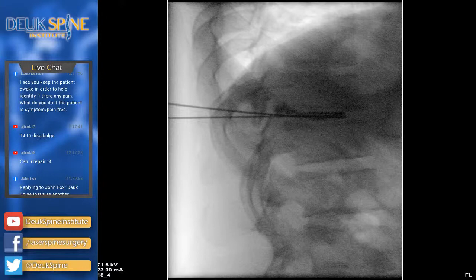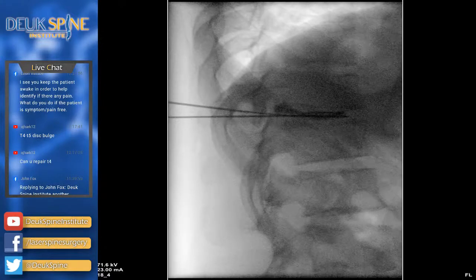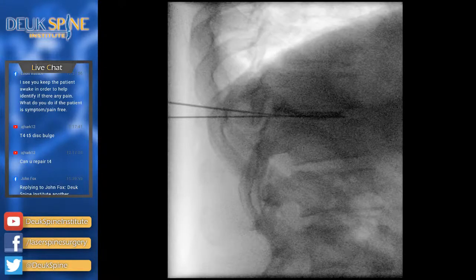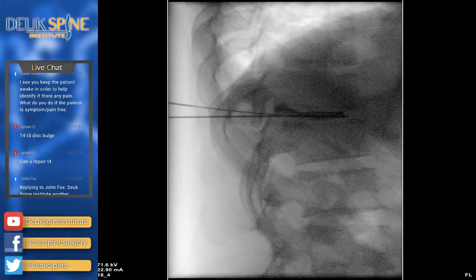So now we know the front of the guide wire is where we want it, so I'm going to leave the guide wire there and take the needle out, shot. And I'm going to keep checking to make sure that I haven't moved. How's our blood pressure? Good. Perfect. I'm going to make sure I don't move the guide wire. Shot? That's it? All right, that's perfect. So here we come out with the needle. Shot? Guide wire is still in place.